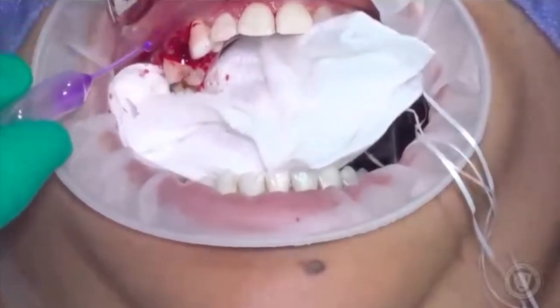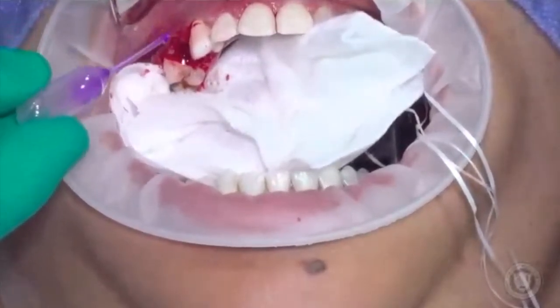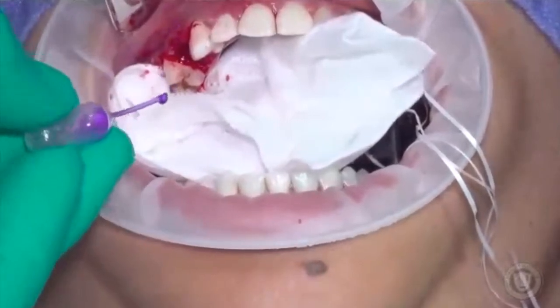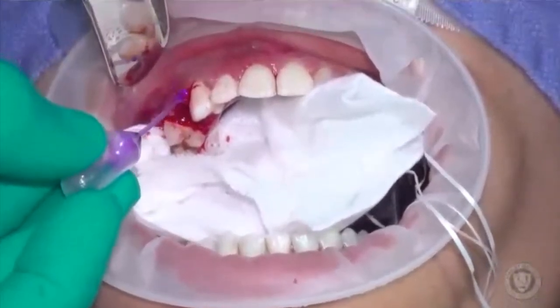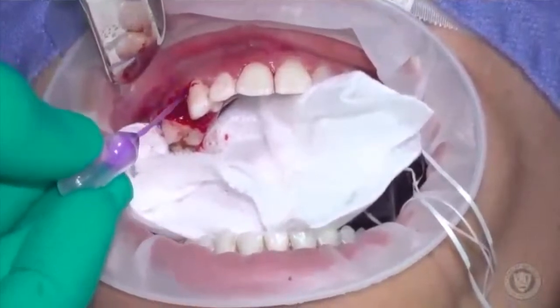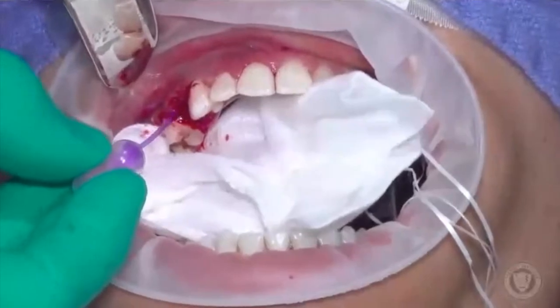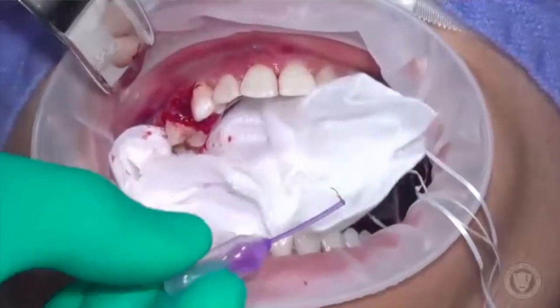Note that here on the buccal, I haven't done a full thickness flap — all I did was really elevate the papilla. So I just want to encourage them to stay in place. I'm just gonna touch right at the distal of the canine, and then go to the mesial of the premolar and touch right there.